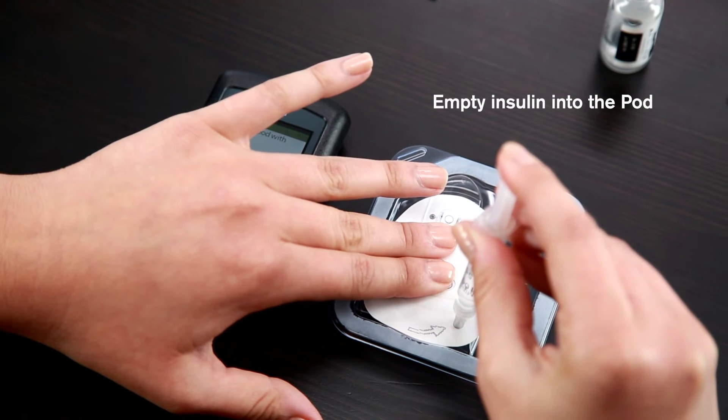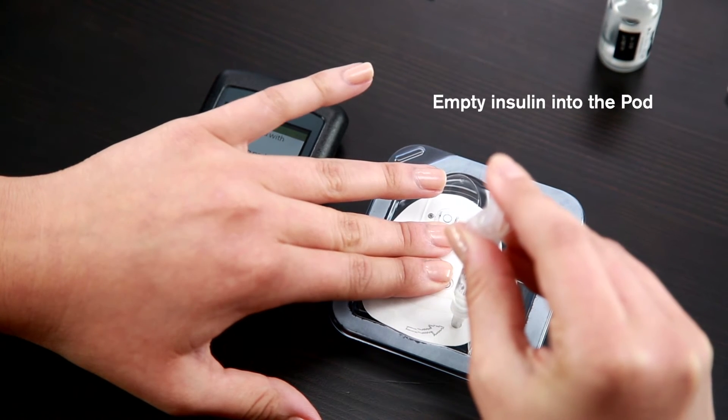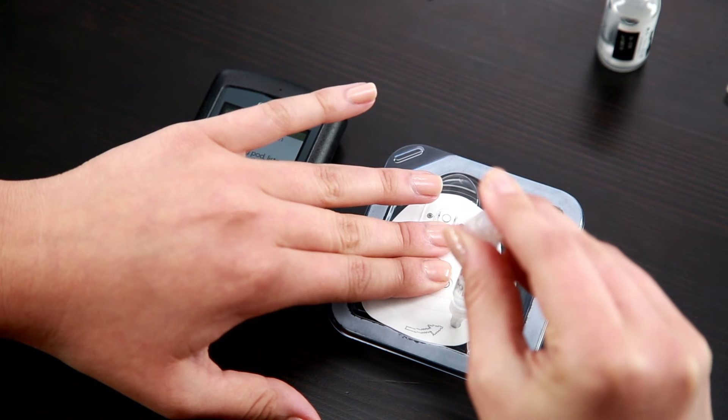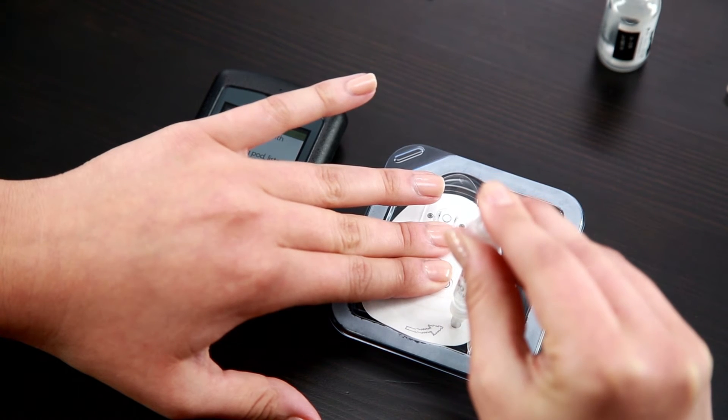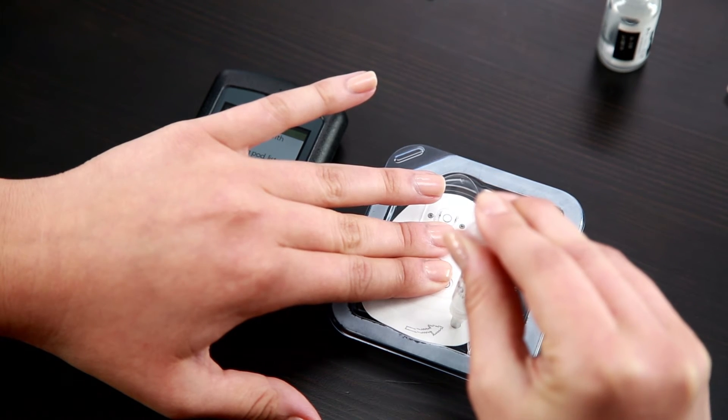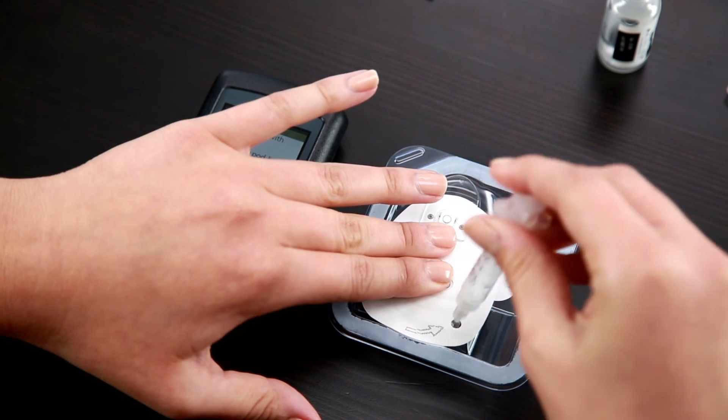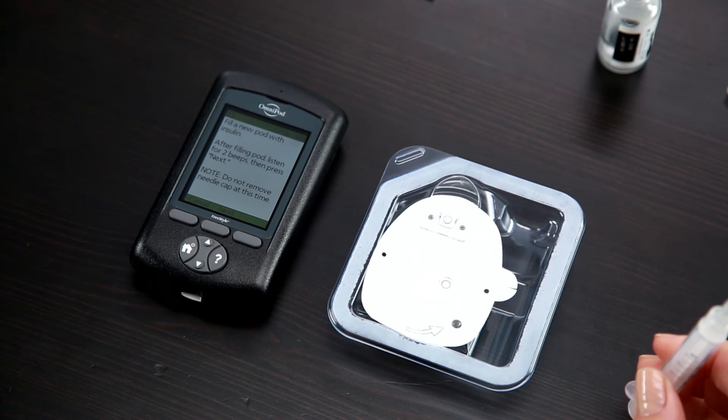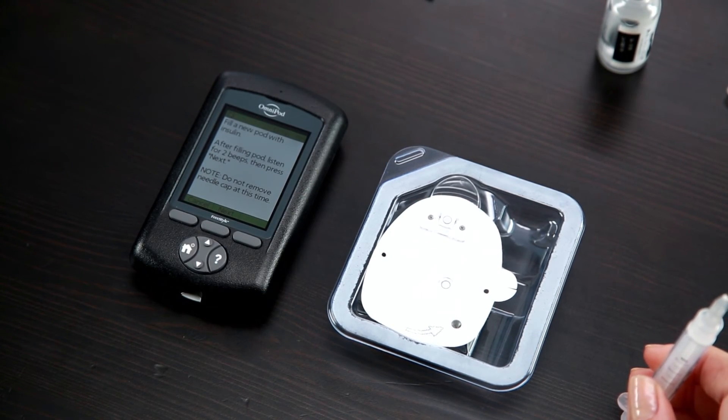Make sure to completely empty the syringe into the pod. If you hear two beeps and you still have insulin left in your syringe, continue filling until all the insulin is transferred to the pod. The pod will beep twice, indicating the system is ready to proceed. Please note it is important to hear these two beeps before you proceed.